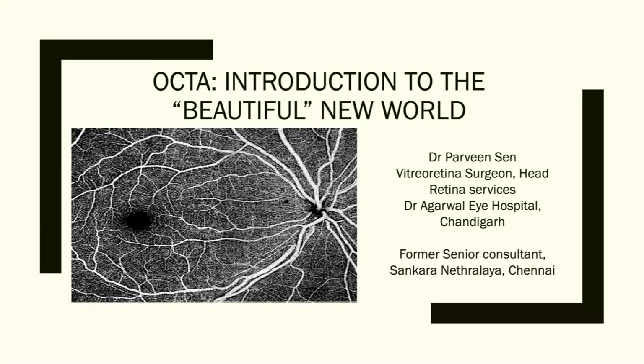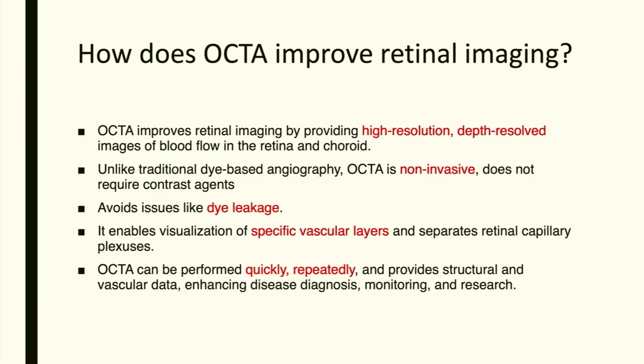So I think my talk has been made easier by the previous speaker who was speaking on OCT, because OCT angiography without OCT is again something which should not be done. It has to be after you have done your OCT that you go to OCT angiography. So whether it is beautiful or not beautiful, you decide after you have seen this presentation.